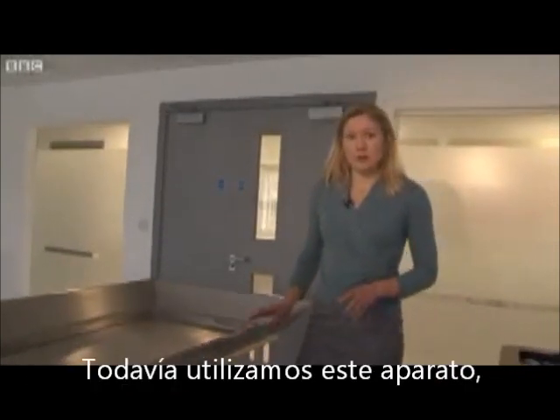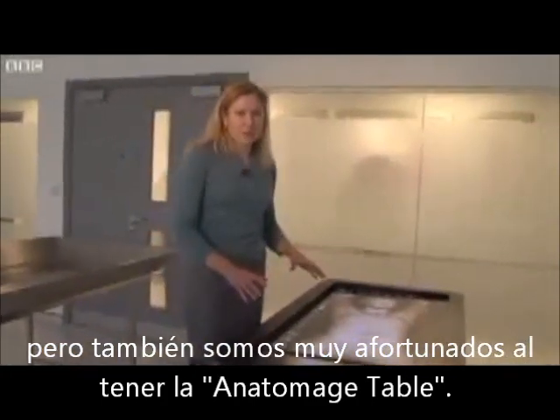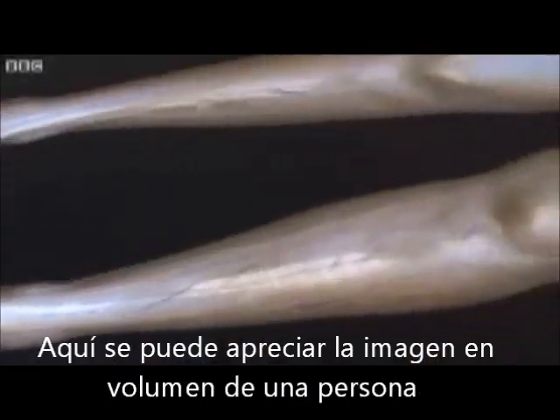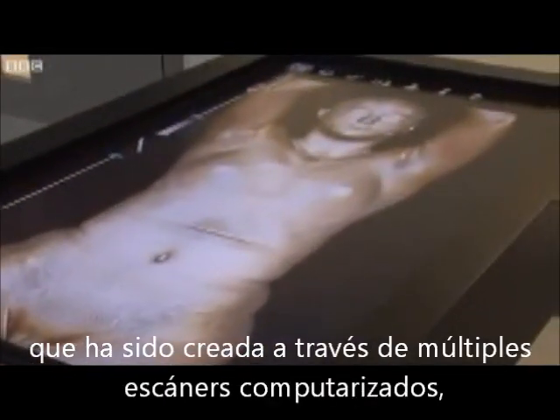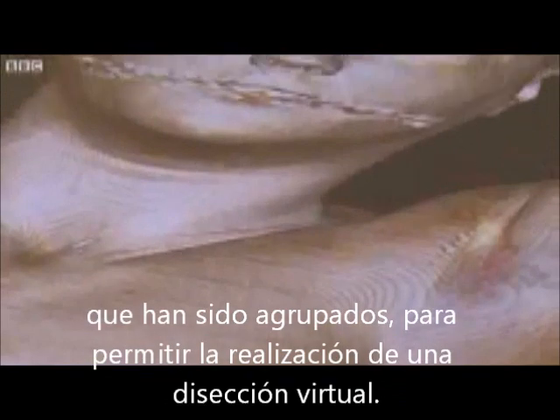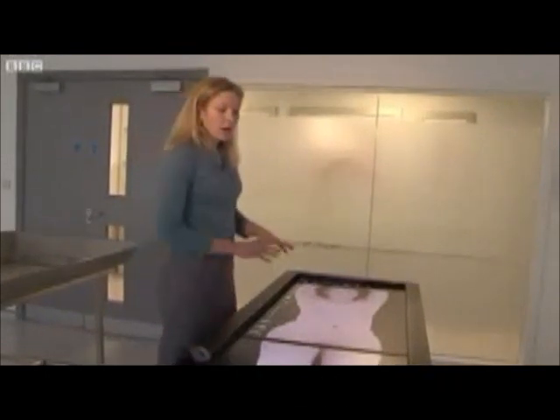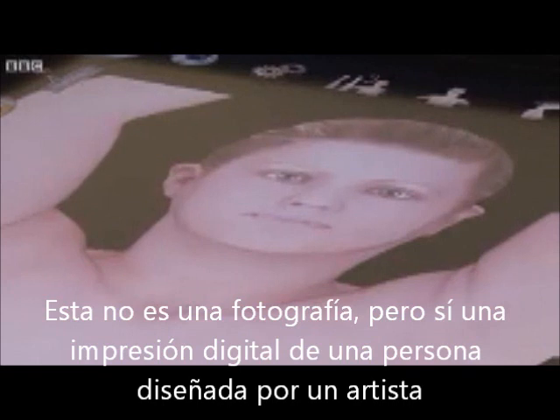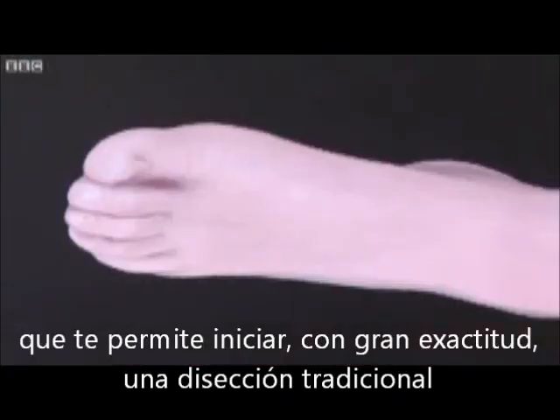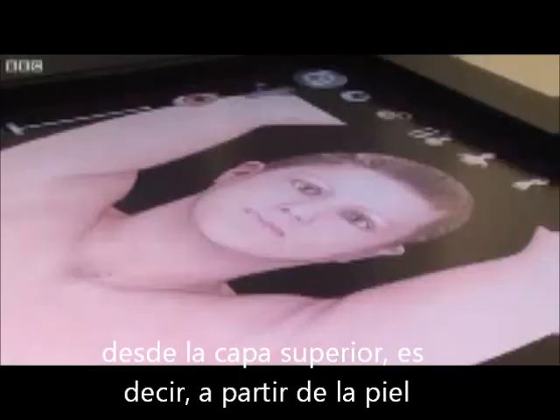We still use this to an extent, but we're also lucky enough to have tools such as this Anatomage Table today. You can see on here we've got a volume rendered person created from multiple CT scans that have been put together in order to allow us to perform virtual dissection. Starting from the top layer, this is not a photo but actually an artist's digitally rendered impression of a person, so that you can start exactly as you would do with traditional dissection at the top layer, the skin.